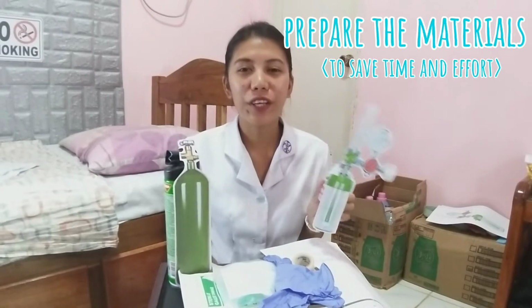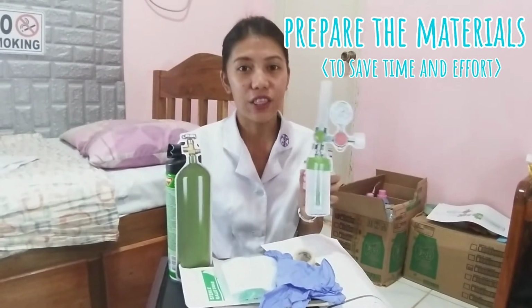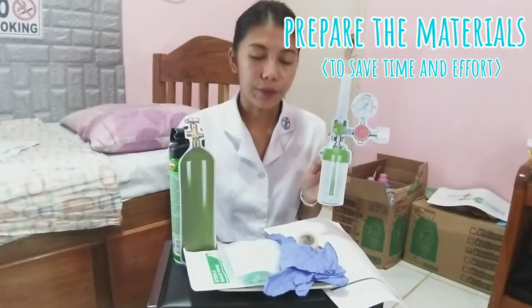So first, we are going to prepare the materials that we are going to use in this intervention. This is to save time and effort.